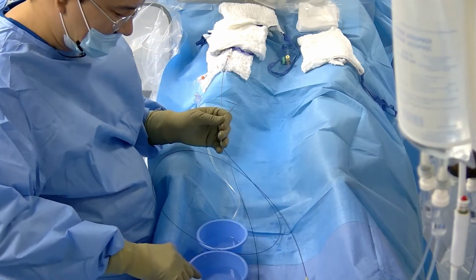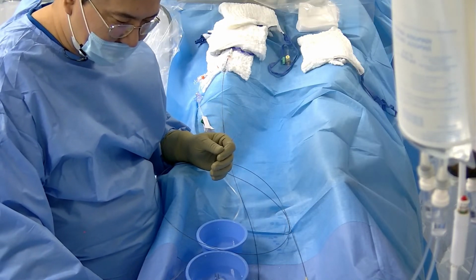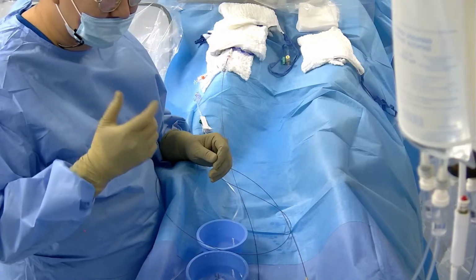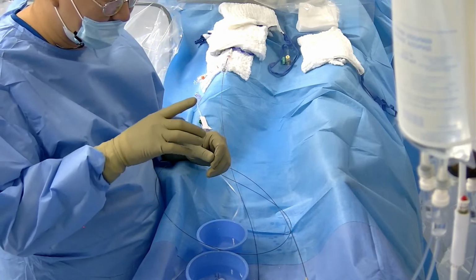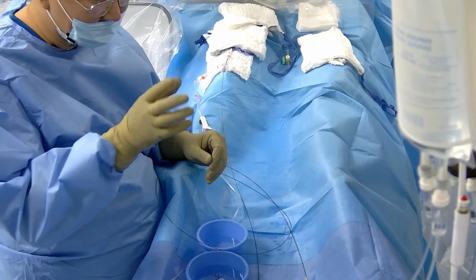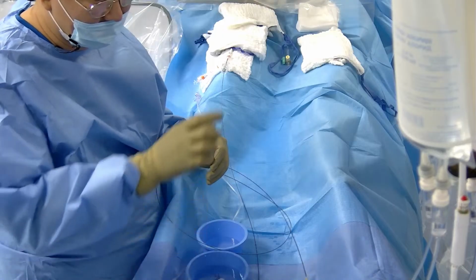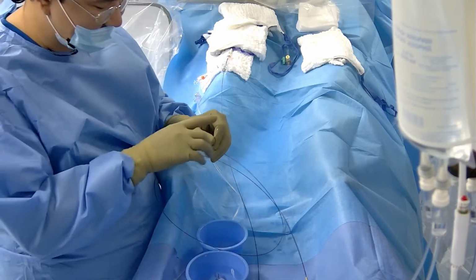At that time I was a user of Hyperglide, Hyperform, and I didn't expect that in the dead space so much force, and during the injection I couldn't see the balloon, and it was a Philips machine. It was just one screen active and not dual fluoro. In dual fluoro we can see the unsubtracted image also, but it was only the subtracted image on roadmap, and the balloon was inflated till 1 centimeter.